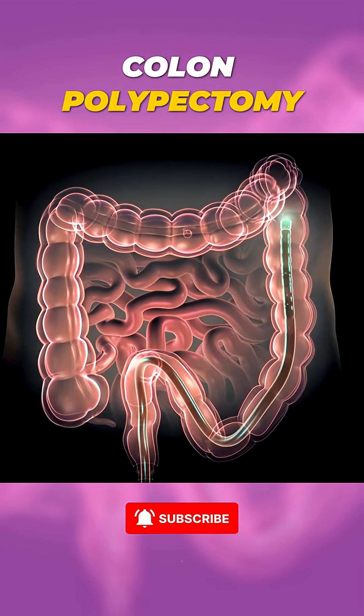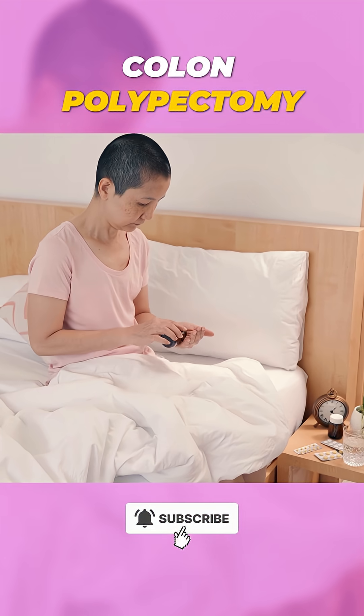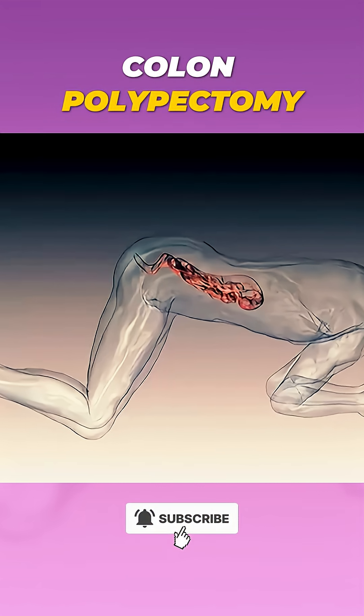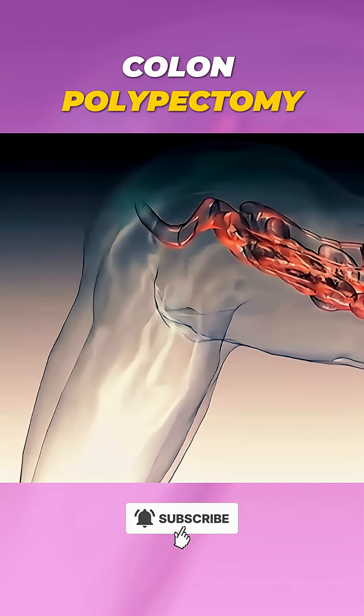The whole procedure is quick, usually painless, and most patients can get back to their normal routine the very same day. It's a simple yet life-saving process that helps protect your health.